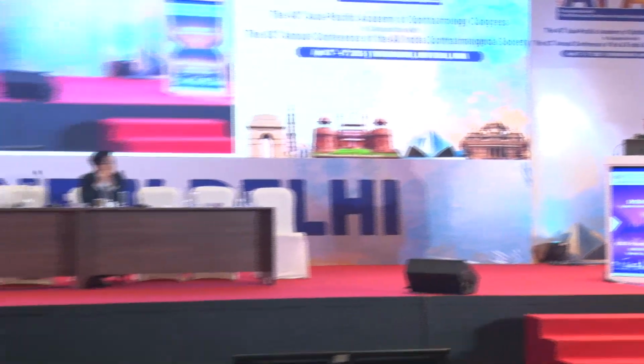Thank you, SJ. Excellent presentation. I think very useful tips. And I think those radial cuts are really very helpful. I routinely do it even before I do a fluid exchange. They really prevent slippage. I just have one question for you.